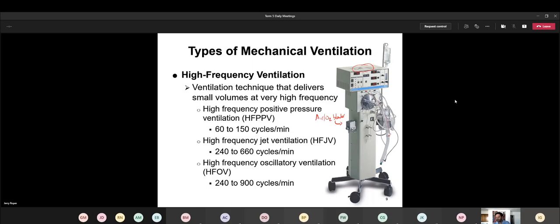And then as you see here, of course, you have to have humidification with this. There's no HME that you would ever use for one of these. You've got to use a heater with these. So there's of course our constant feed drain bag into our heater system. And then there's all these color coded little connections here. There's a red one, here's a blue one, and then there's a green one. Now, if you were actually at the machine and you could see exactly, it's going to tell you which one of these is which. You know, there's a white one as well.